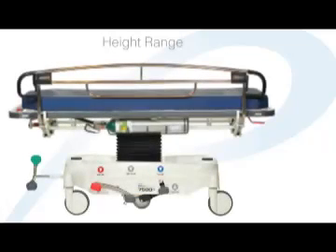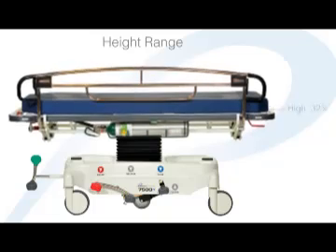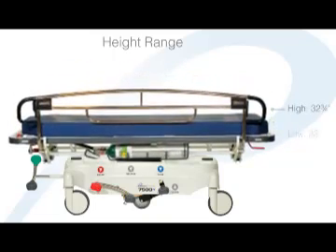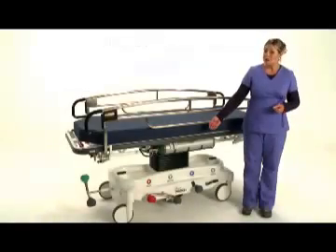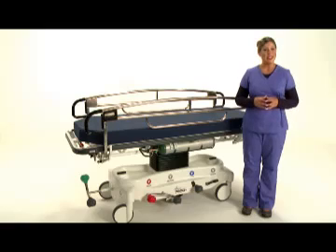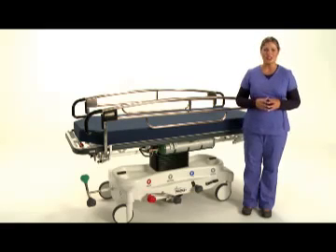The height range for the 7500 stretcher is measured from the top of the metal litter surface to the floor. We exclude the mattress due to the variable thicknesses of stretcher pads. A maximum height for the 7500 stretcher is 32 and 3 quarters inches and a low of 23 inches. Here on either side of the stretcher you'll find four color coded function pedals. These foot operated pedals, placed within the patient care zone, are readily accessible and easily understood at a glance.